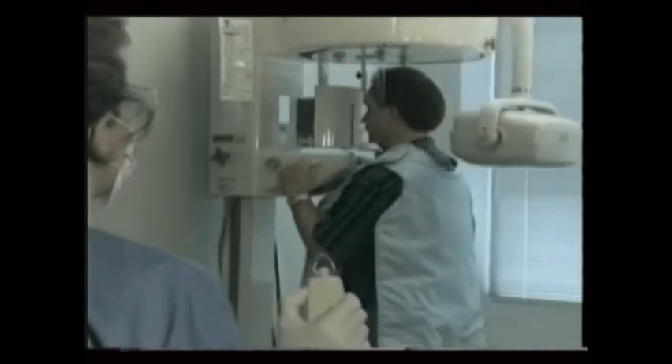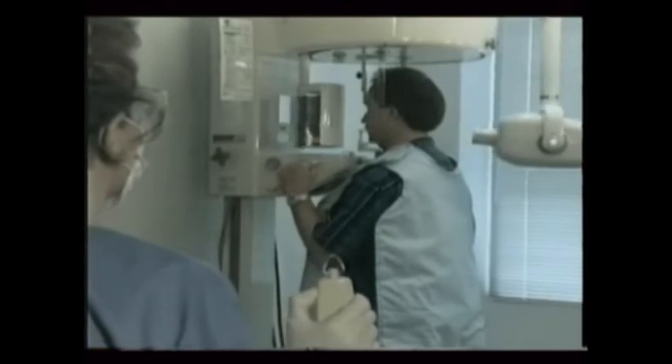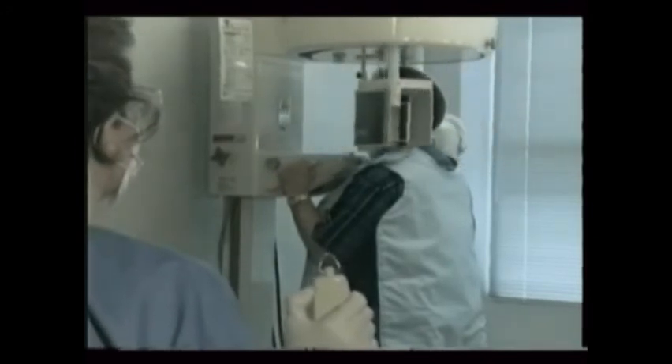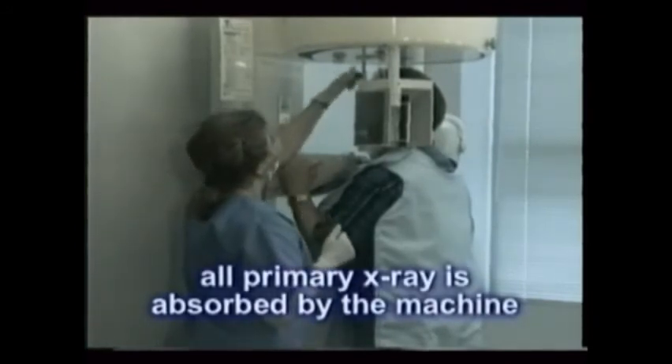Watch now as this dental assistant places and exposes a patient for a panoral radiograph. Notice how she steps at least six feet from the tube head. Since it obviously rotates its primary beam, she can never really stay behind it. There's no real need, though, since essentially all x-ray is absorbed by the film cassette and the x-ray unit itself.